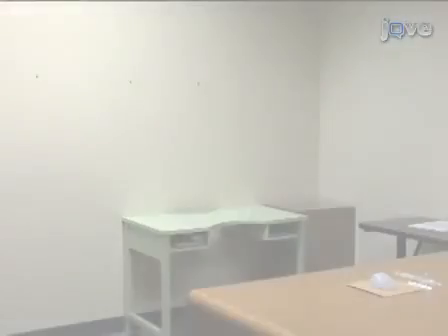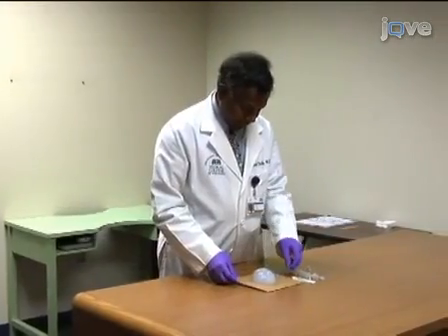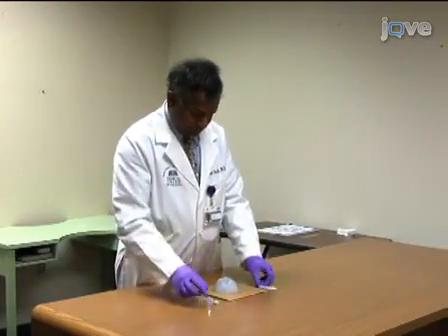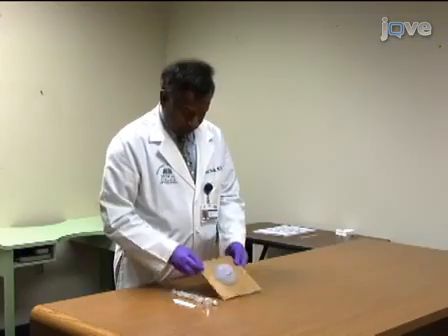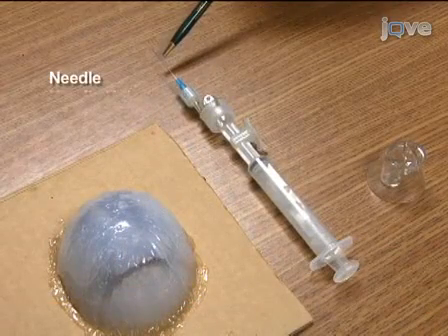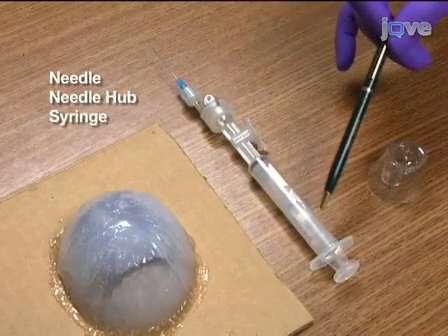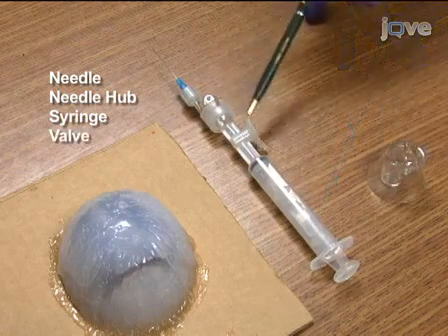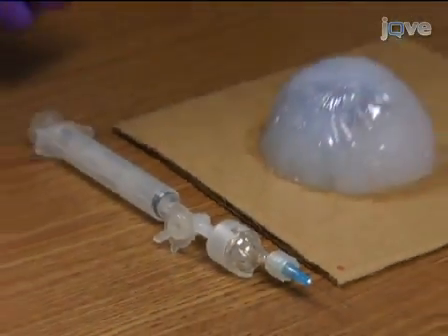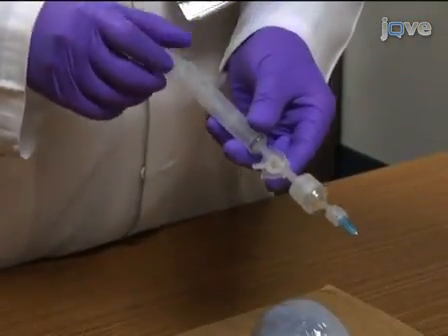Now that you have prepared your phantom lesion and it has cured, you can use it to practice the FNAB procedure. Here, we are using the tissue harvester with functional valve, but you can use any FNA system. In brief, the THFV consists of a needle to pierce the specimen, a needle hub to collect aspirated material, a syringe to control the pressure inside the device, and a valve to connect and disconnect the needle hub from the syringe. Begin by preparing the FNA assembly, with the valve connecting the needle hub to the syringe closed.